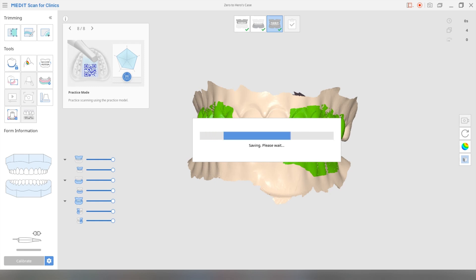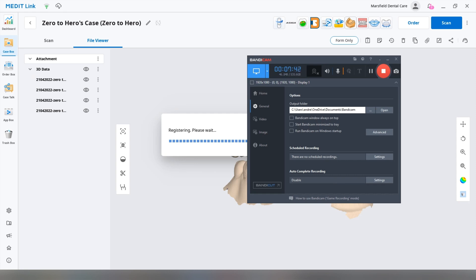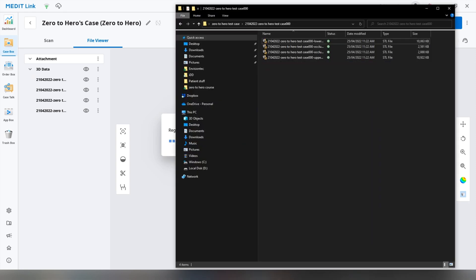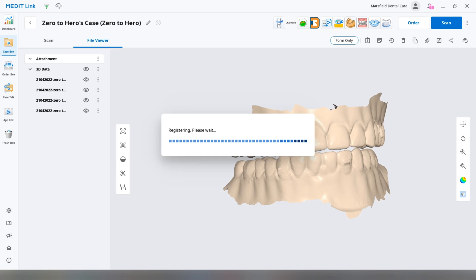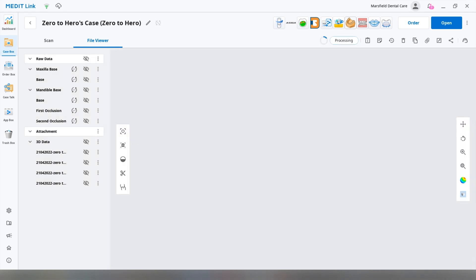Now that you've basically converted those attachments that you did right at the start that you attached to the patient's profile, you've now basically registered them as an actual scanned model or scanned arch. And now you can use that for your model builder once it finishes processing.